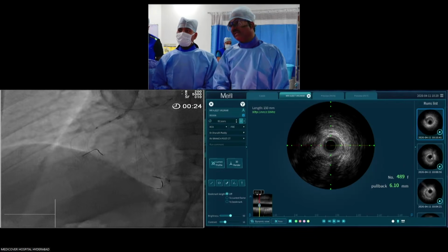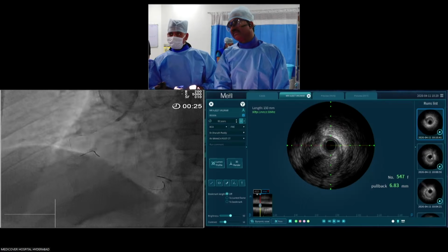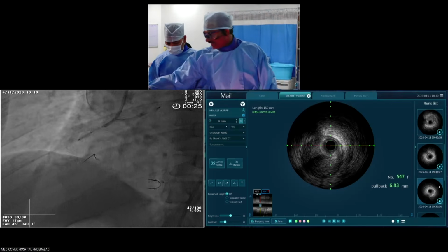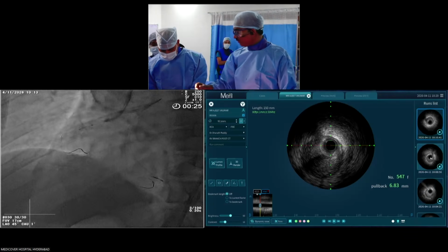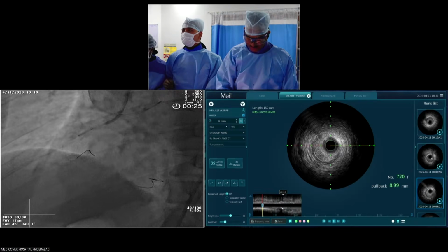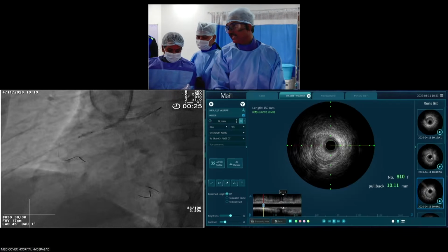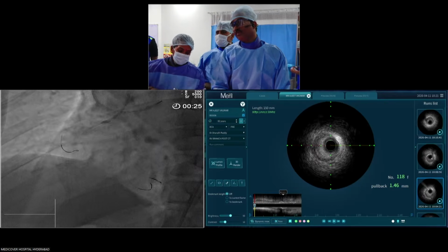What's the size? What's 8? Okay. Now just give me IVUS. Yes, it's not diffusely diseased. You can show the first IVUS of the RCA. It is a negatively remodeled vessel, so that's the reason I thought of even doing a 2 mm longer balloon. Give me a 2 mm long balloon for distal RCA dilatation. It's a negatively remodeled vessel because there is no block anywhere. Dr. Daya, are you showing the RCA? You can see this is the distal RCA. You can still go down and show. See, there is no catheter.